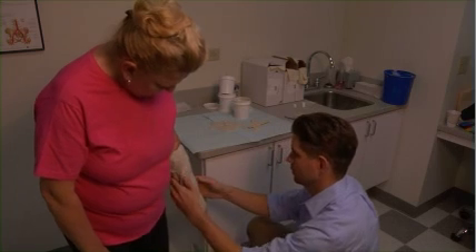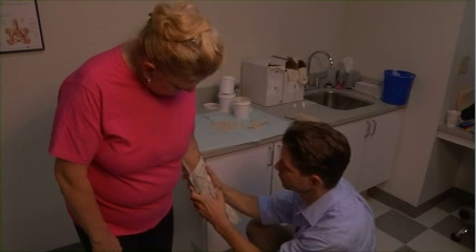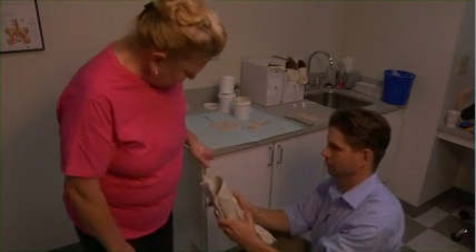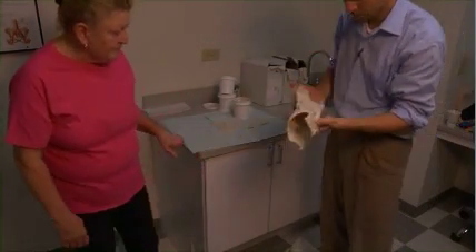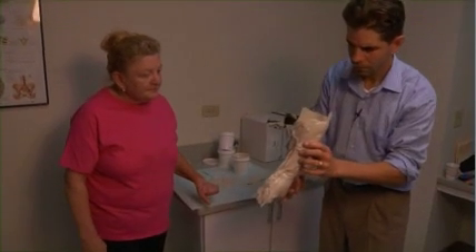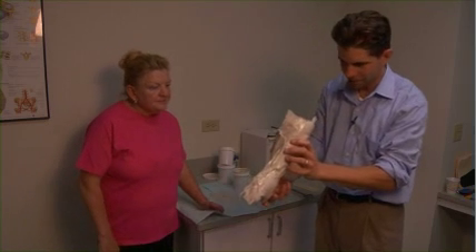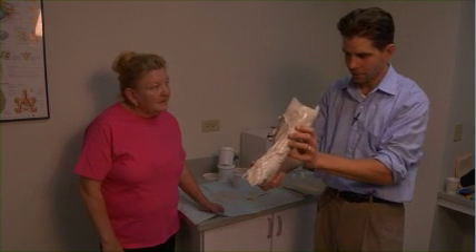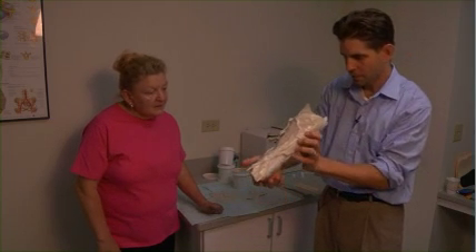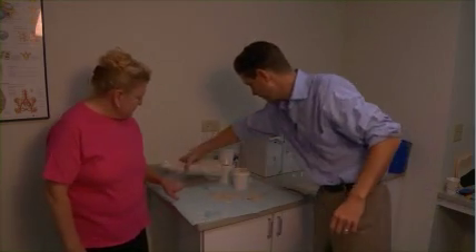Let's wait a second. Okay, let's start back. I'm just inspecting it right now for anything I'd say, oh no, let's do it again. It's a little thin in some areas, but I don't think we're violating any minimal thicknesses, so we're good. Let's clean you up here.